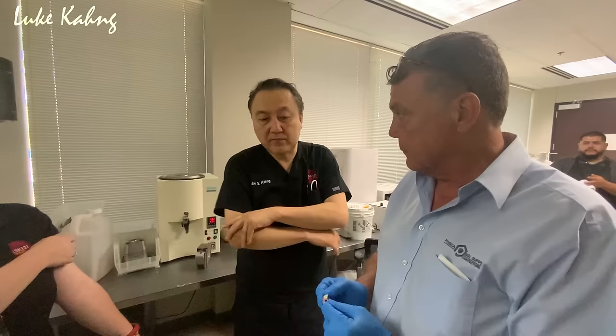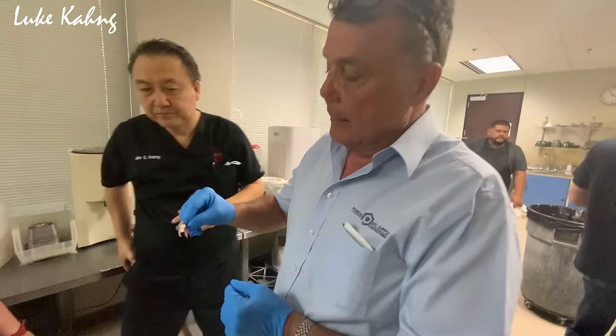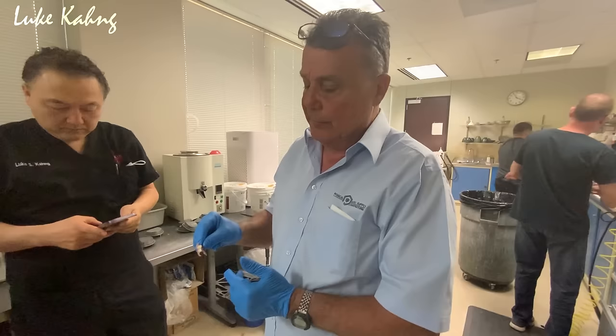This is a separate partial, acrylic partial too. Flex partial, how about flex partial? Semi-flexible acrylic partial, when we lose the fit, how can we fix it? Okay, you get a cup of hot water, you place it in the microwave. Place the partial that's loose and immerse it into the hot water for about 30 seconds.